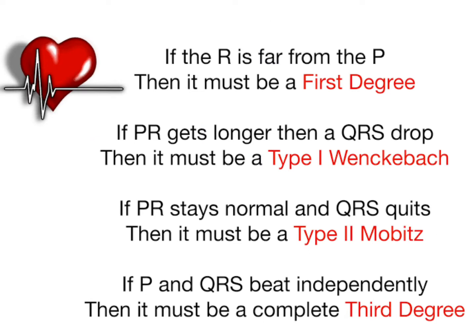The different degrees of heart block can be remembered with this poem. Someone has written it beautifully. If you remember this, you will find it easy to remember the heart blocks.